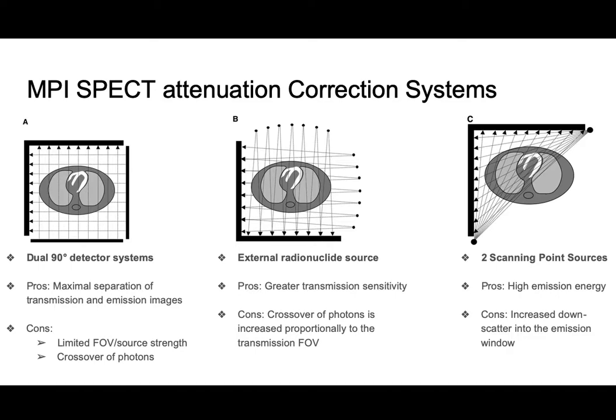So I'm not sure about how they calibrate it for a CT system, but for this external radionuclide source, they can use the same tracers. Right. Yeah.